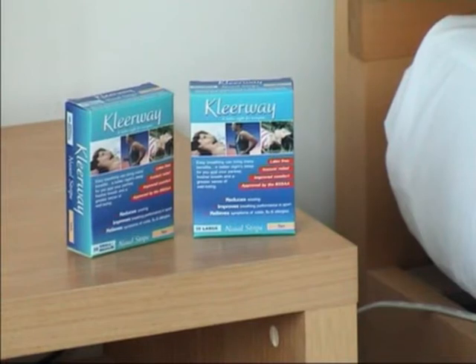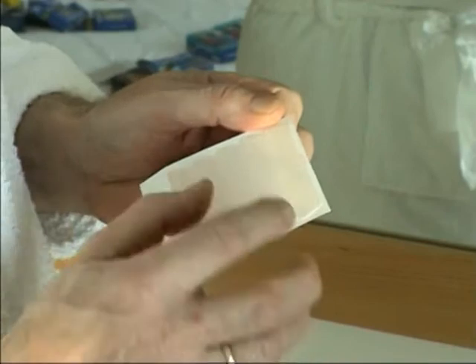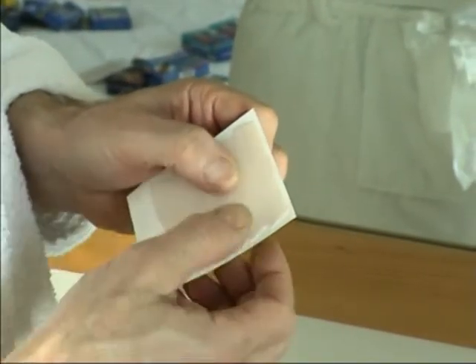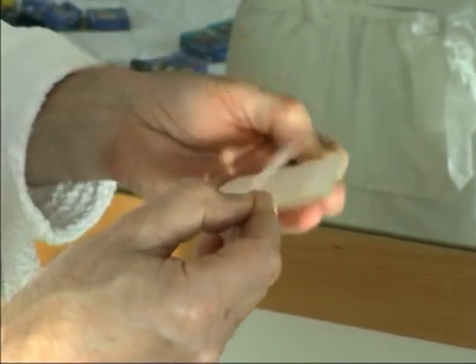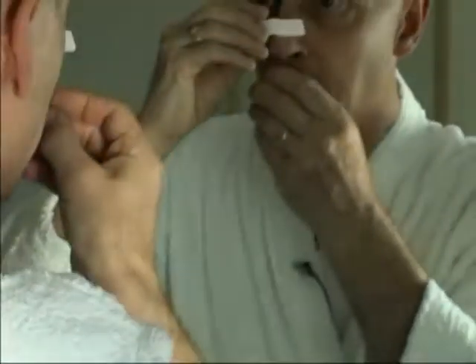I'd like to show you how to put on a Clearway nasal strip. This is the large size, and this little bit here denotes the top of the strip. Carefully peel one off of the backing strip, try to avoid touching the adhesive, and then pop it on there like that.